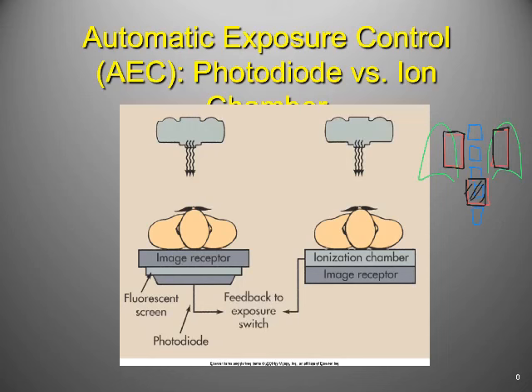Now let's think something weird. Let's talk about the lateral. Okay, so here's the same anatomy from a lateral point of view, right? Now what of the ion chambers on my triad pattern do I want to energize? Upright. Possibly, generally, it's this one right here. It's normally just the middle one, right? Because it's going to catch the lung the most.